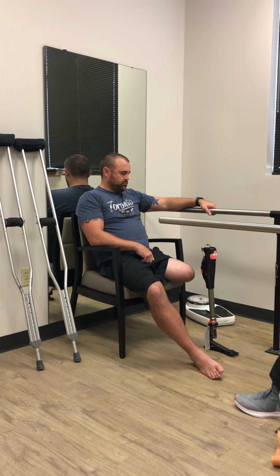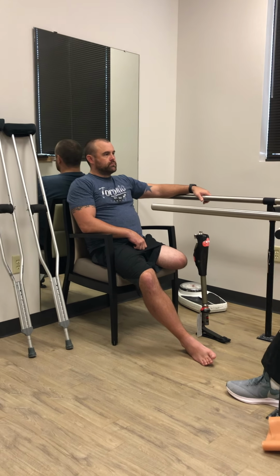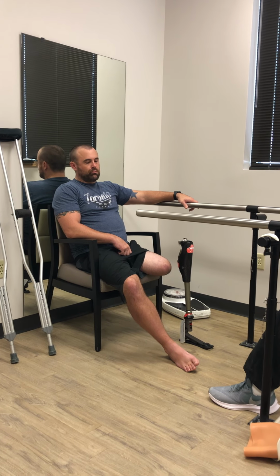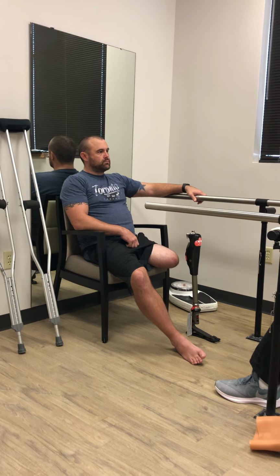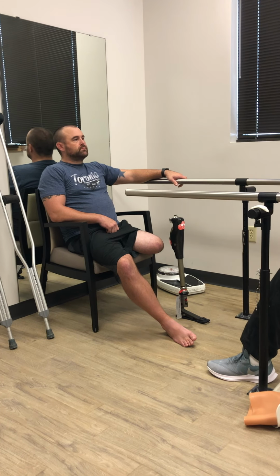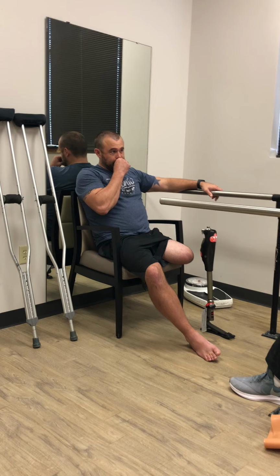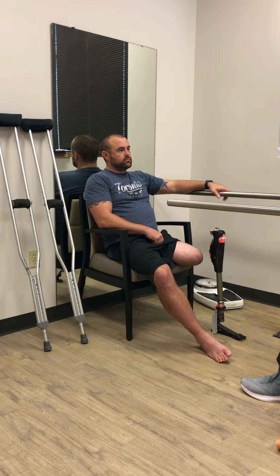Getting back to the socket, will you piston in certain types of sockets if your volume has changed? Yeah, absolutely, that's part of the game. If I could run this into your skeletal system, it would be a lot lighter, and you wouldn't have to worry about sockets and weight gain, weight loss, fluid, that kind of thing. But that's really the driving force behind the sockets changing.